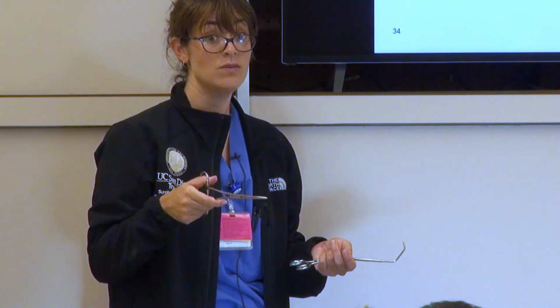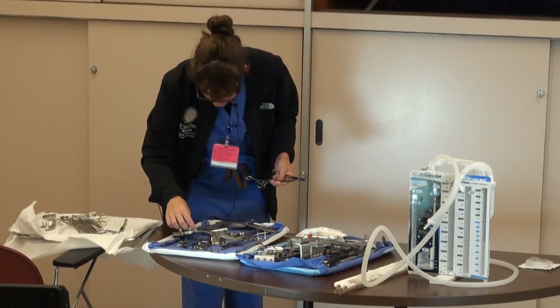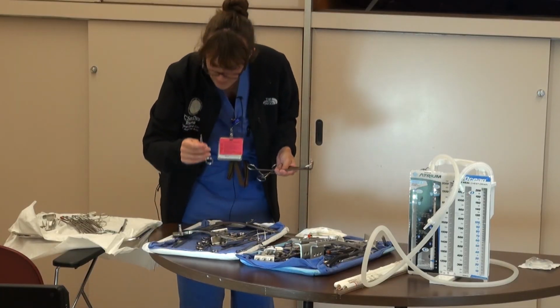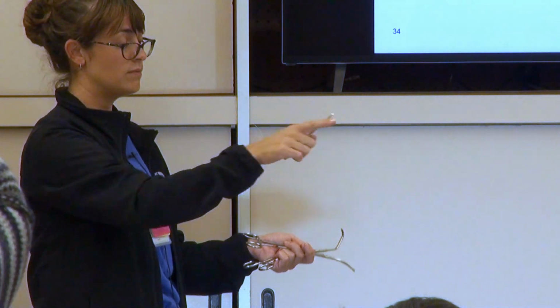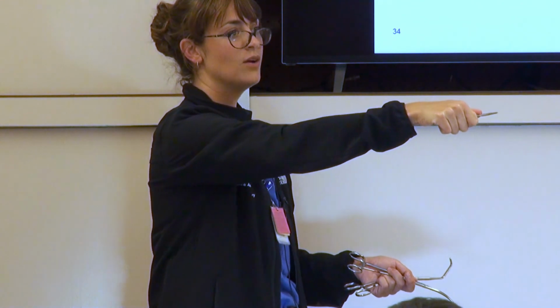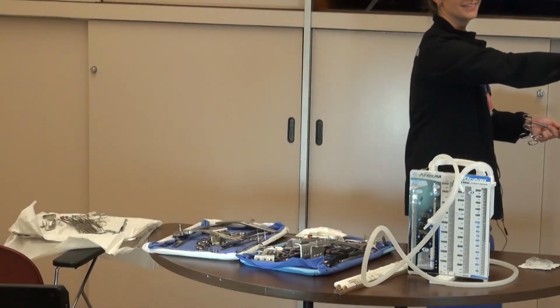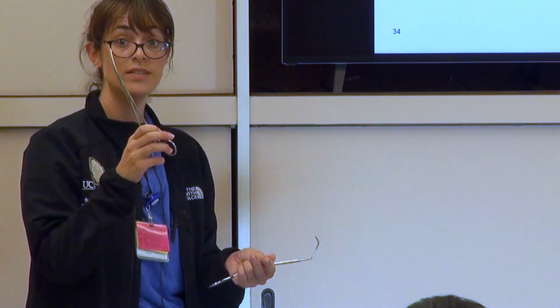So you can't see well, right? A lot of it's by feel, and you're trying to dissect that space. It's really hard. The last time I did it, I actually had to just tear it open with my finger because someone handed me something about this size, because we were in duress. Can I get into the chest with this? Where is my hand now? All the way in, right? I can't see what I'm doing, and I can't dissect, and it's not going to work. So long instruments are the best.